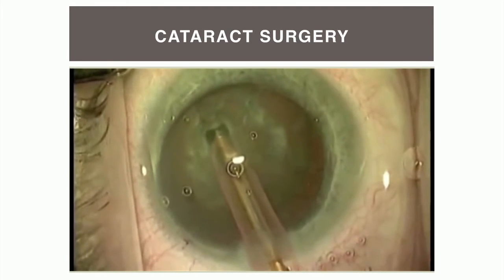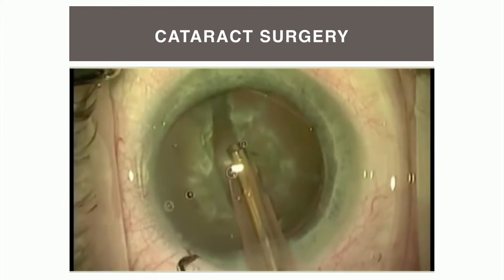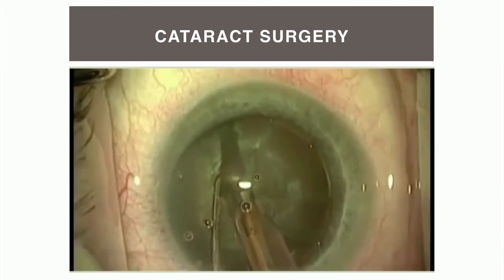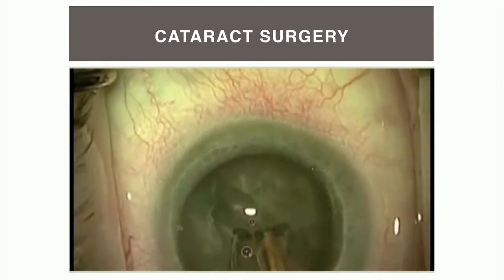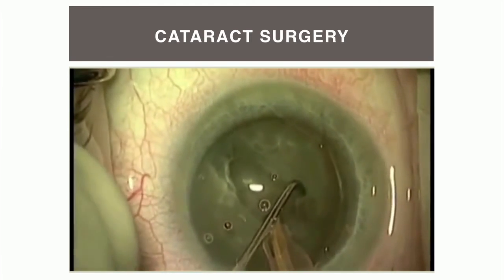And this is an ultrasound probe. And the ultrasound probe causes the cataract to break up into little bits. And aided with a second surgical device here, you're going to see the cataract now crack into a couple pieces.